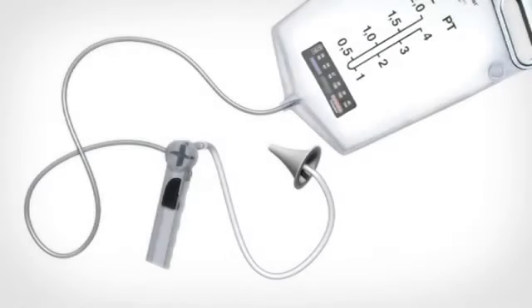When you use the irrigation system, water will flow from the irrigation bag, through the regulator, and finally enter the stoma via the cone.